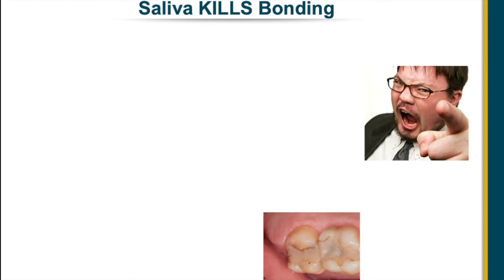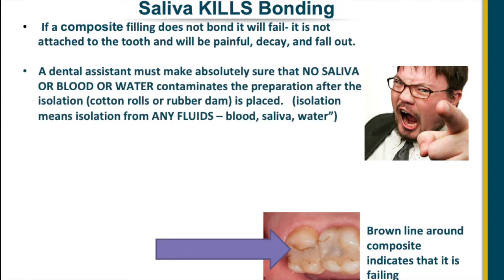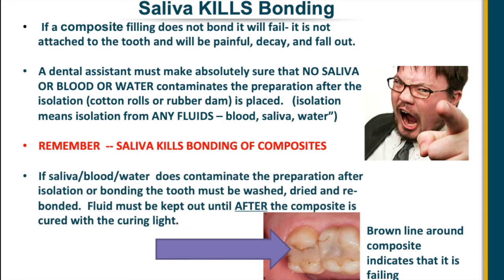but I need to repeat this again, that saliva kills bonding. It's really important you understand that, and you do not allow contamination of the bonding once it's placed. So the dentist cannot leave a patient breathing on a composite filling, or shouldn't, once the bonding is done. The filling should go in immediately. So it's really important that you keep that restoration isolated. Saliva kills bonding of composites.